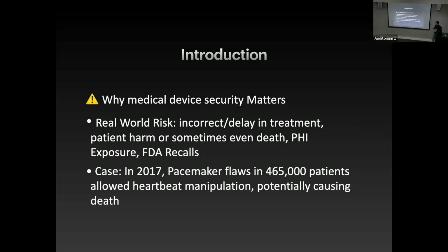It's about patient safety. For example, in the case of a patient heart monitor, if an attacker could tamper with the readings or values shown on the display, then it could lead to patient harm, such as delay in treatment or incorrect treatment, or sometimes even death in the case of a pacemaker or implantable. If those devices are capable of accepting unauthorized commands, the result is catastrophic. Then come the typical data losses like PHI exposure, then the typical regulatory consequences like FDA recalls, business reputation damage, etc.